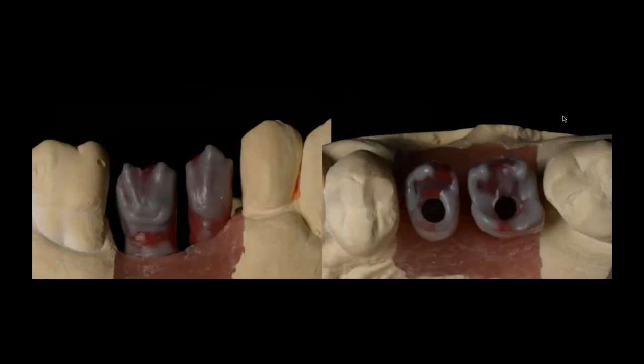So I like to tell everybody that basically for me, the way this should always work is your substructures should support your light reflective index, how I want light to bounce or be absorbed or be reflected. But it also should be a baby version of what the final tooth will look like. And for that, I want to really make highlights, and where I'm looking for light reflectance, light absorption, and support for my ceramic layering that I'm going to go through in the process.